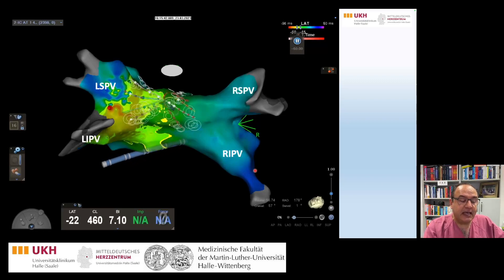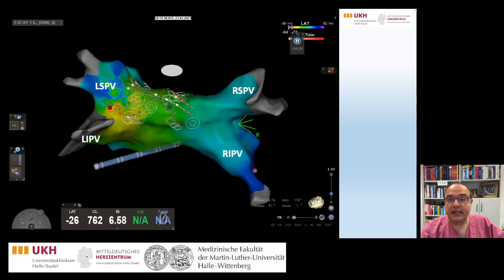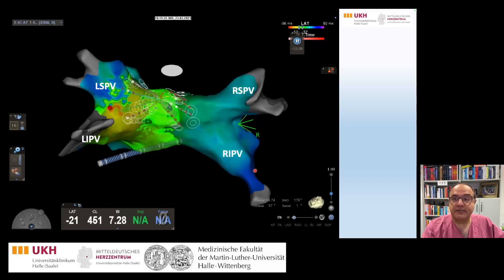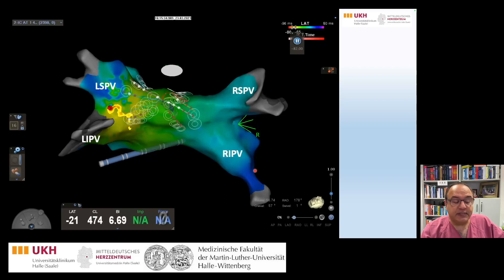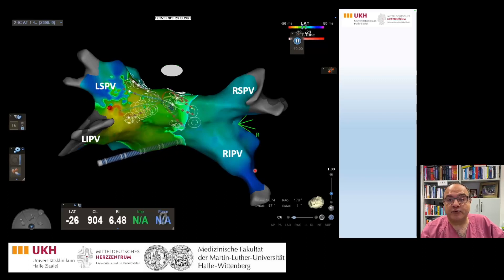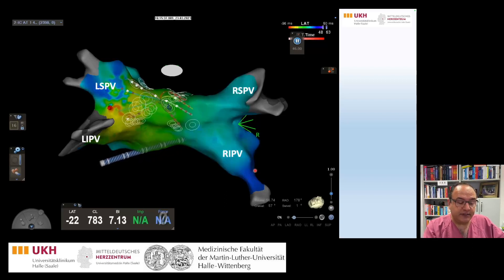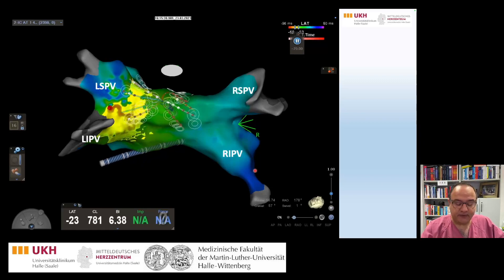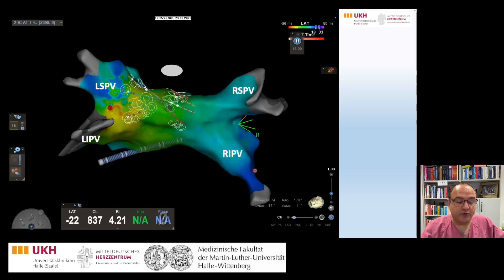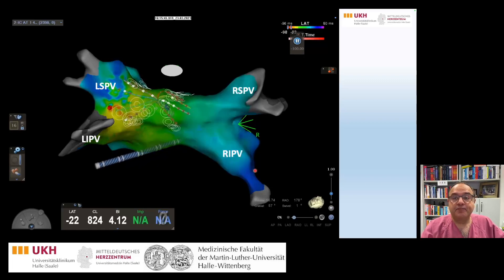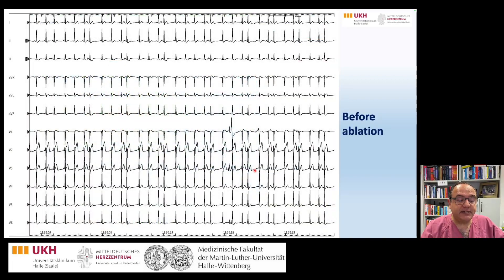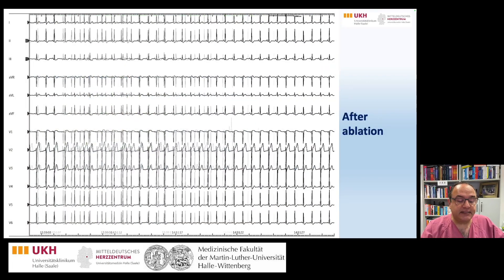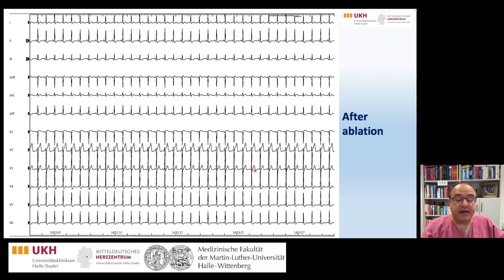The map shows a close proximity of the PAC to the left superior pulmonary vein — actually on the ridge between the left superior and left inferior pulmonary vein — which was successfully ablated. This is the ECG before catheter ablation, and this is the ECG after catheter ablation.